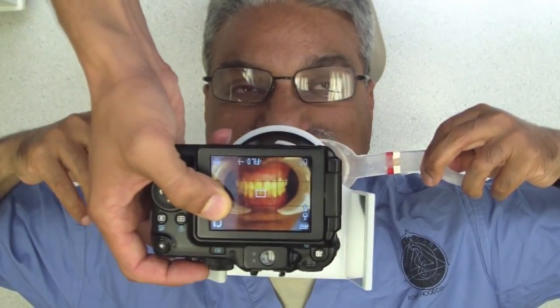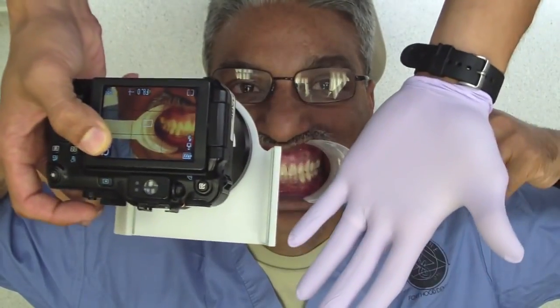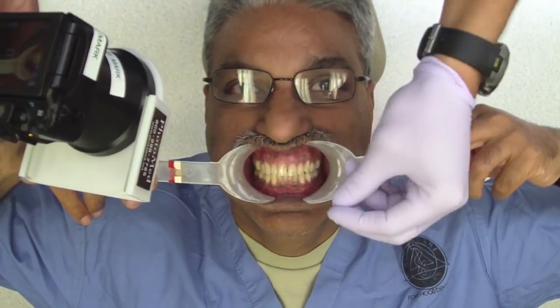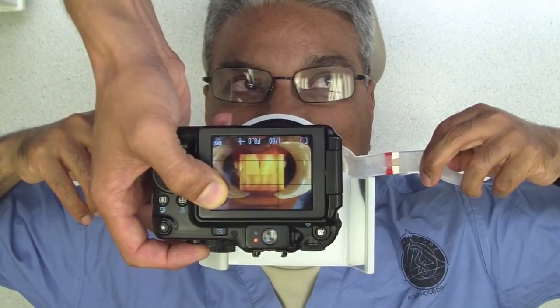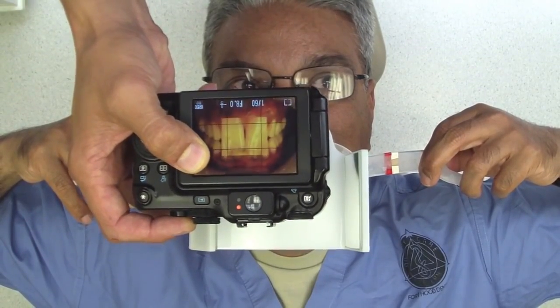So the initial shot, what we're going to do, and you can change the angulation. You can see on my camera here, and typically I have one hand with a glove and the other one is on my camera, and I use the one hand with the mirror and retractors. So in this technique you can see that I'm just going to focus in and grab my photos, and I can zoom in and out. Of course, if you have a larger camera, it's totally different. These are just really basic photos.